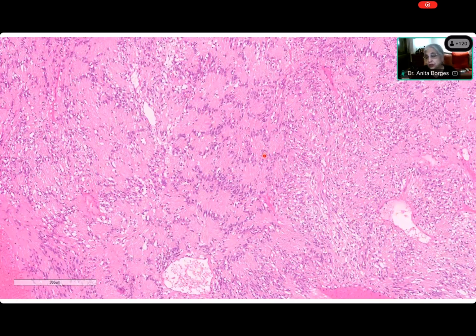Of course, people talk about degeneration. It's not. And when you get a lot of these kind of changes, and the Schwannian part of the tumor is very paucicellular, or it is seen in different areas, maybe only near the capsule or in the center.